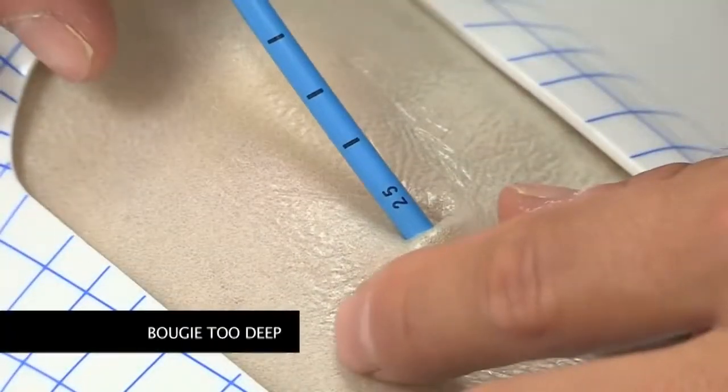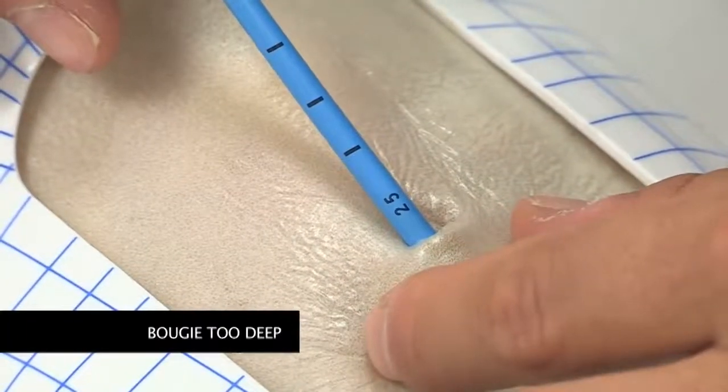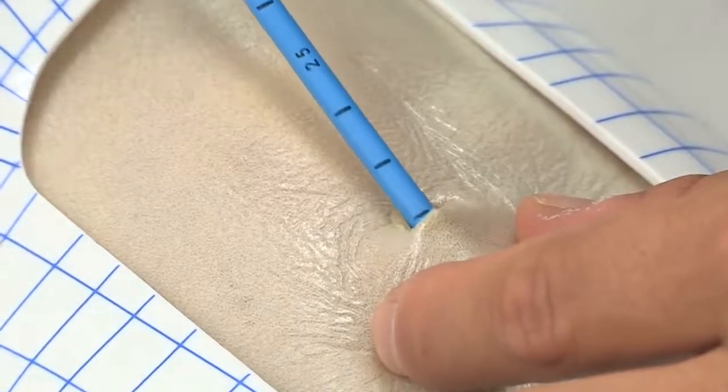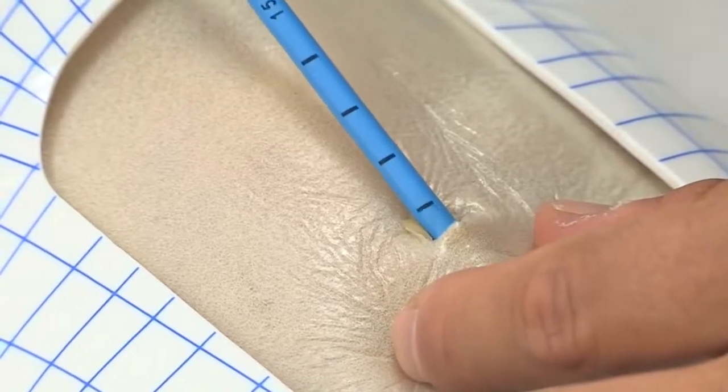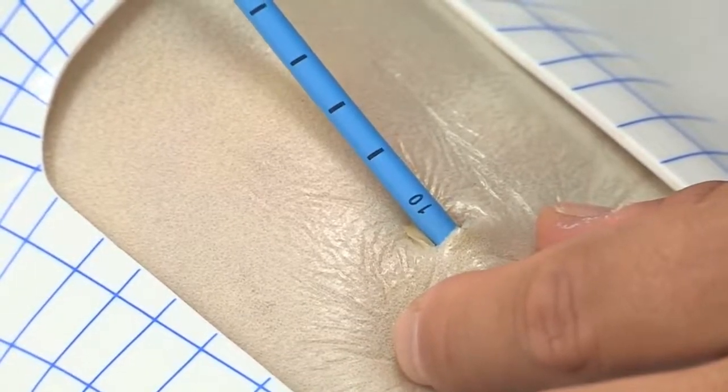Bougie insertion depth should be limited between 10 to 15 cm. If further insertion is required to identify correct placement, it is ideal to withdraw it to this depth prior to oxygenation or tube insertion.